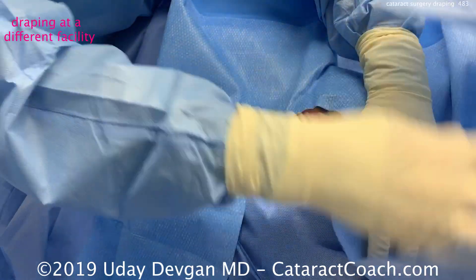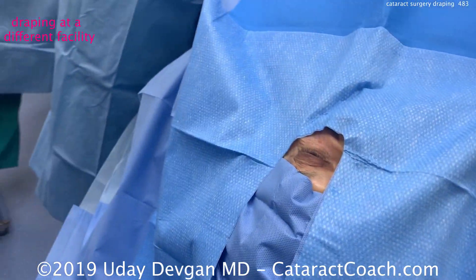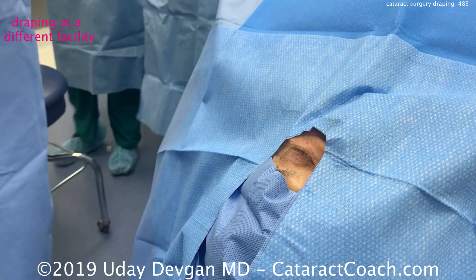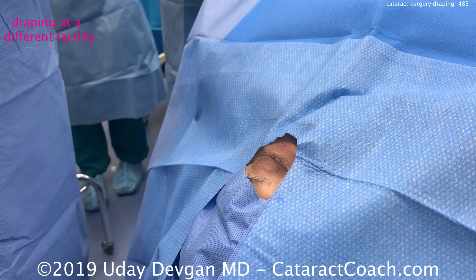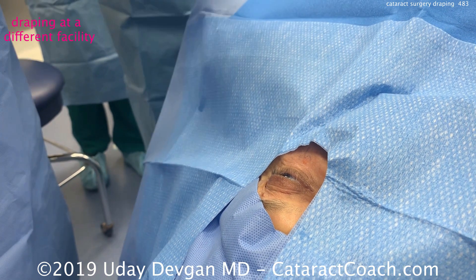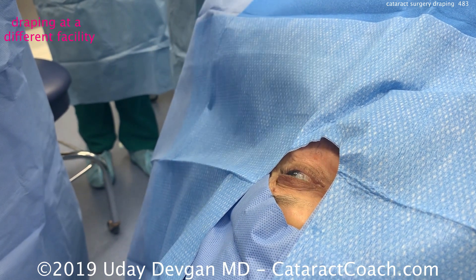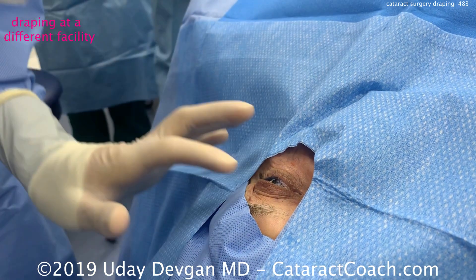Here's it being done in a different facility — this is not our Beverly Hills Center, and it's not me doing this procedure, but I want to show you a different technique. In this technique the patient's eye is again exposed, and the surgeon is going to get a plastic drape. The skin has been prepped with povidone-iodine — betadine.